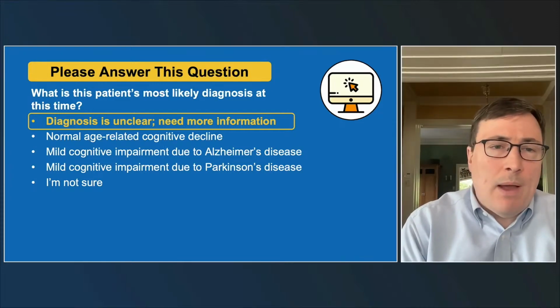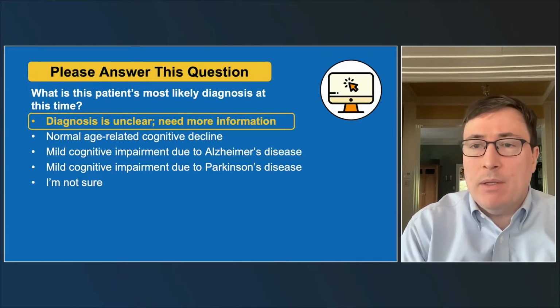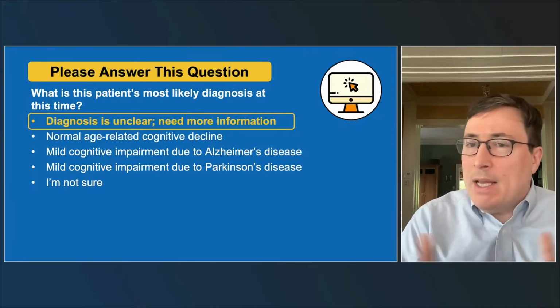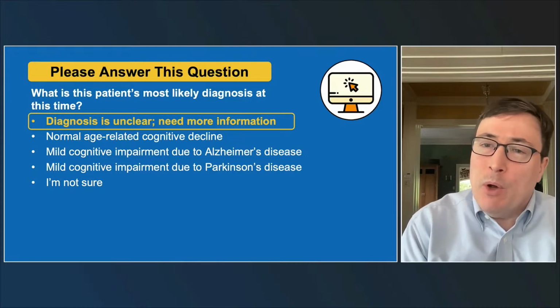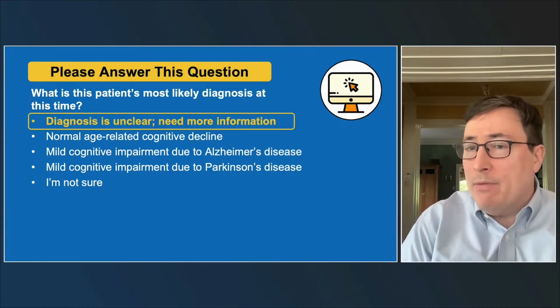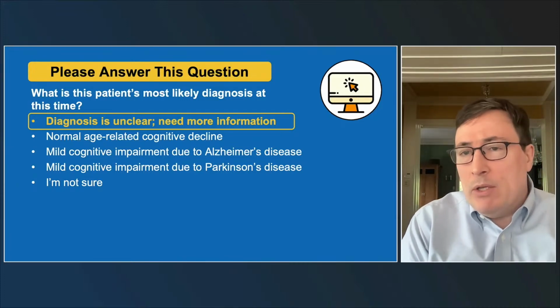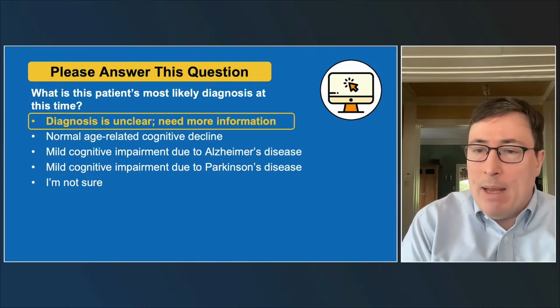Yeah. So one thing I would be interested in knowing from your perspective, I obviously come from an imaging point of view, but in these cases where you might not even quite qualify this person as mild cognitive impairment, currently we kind of think of using amyloid PET in people who have MCI or evidence of dementia, and what's your thought and trigger in your practice for when you might refer someone to amyloid PET?